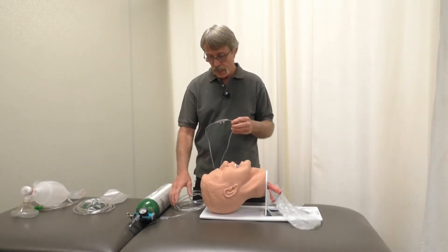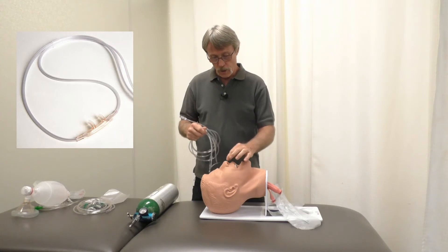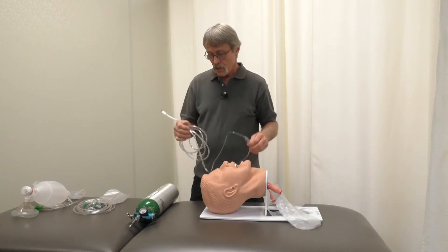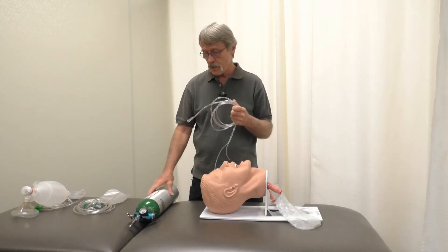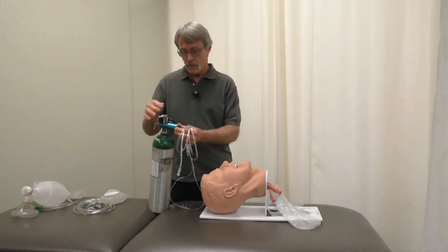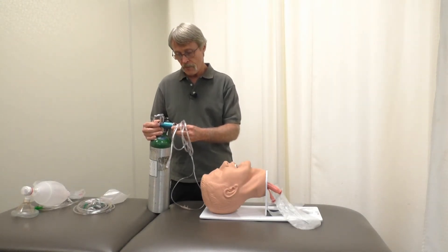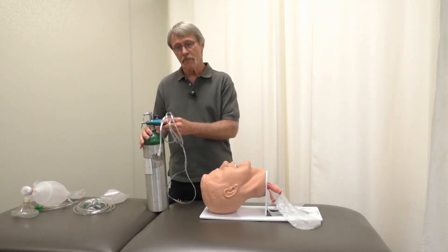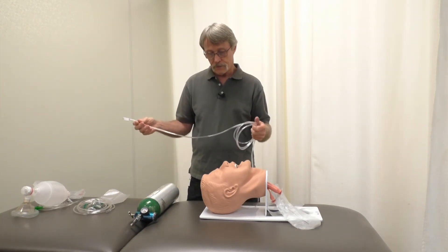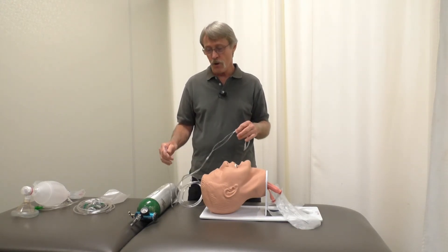First, I'll demonstrate using a nasal cannula. The nasal cannula has two prongs that go up inside the nostrils — the nares — of the patient. With this, you want your oxygen turned on and the regulator set between 2 and 6 liters. Most of the time, 4 is a good number. This is so the patient doesn't feel anxious and it just takes the edge off.